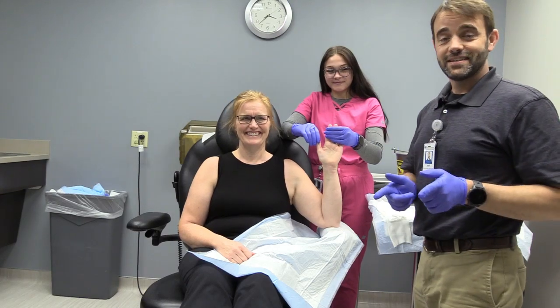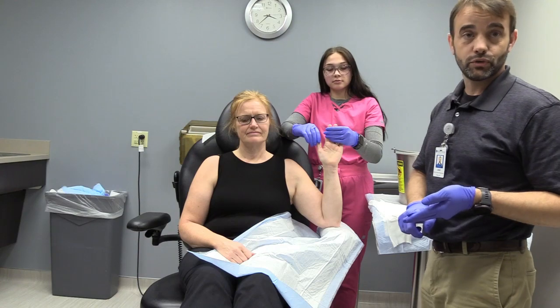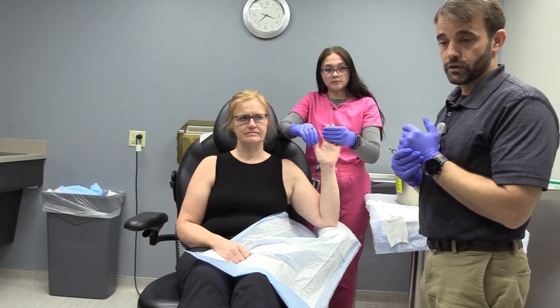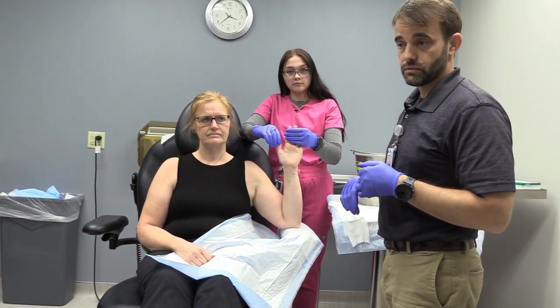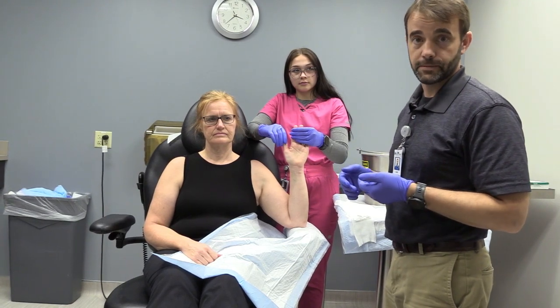So this is an unofficial in-house use only recording of how to do some short arm splinting. We're going to do first an ulnar gutter for metacarpal fractures, and then also we'll do a short arm sugar tongue type on the other side, which would be for like a distal radius.